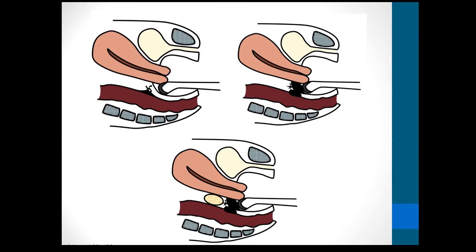So the first extra maneuver that you can do is what we talked about before, which is putting the vaginal ultrasound probe in the posterior fornix, because then you're close to where the lesions are going to be. And what you're looking for, the lesions that you can recognize by putting the probe just in the posterior fornix, is a bowel lesion that is stuck to a uterosacral ligament nodule, or as I said, often you have a uterosacral ligament nodule that may infiltrate into the bowel, cause a bowel lesion, and into the vagina, cause a vaginal nodule.